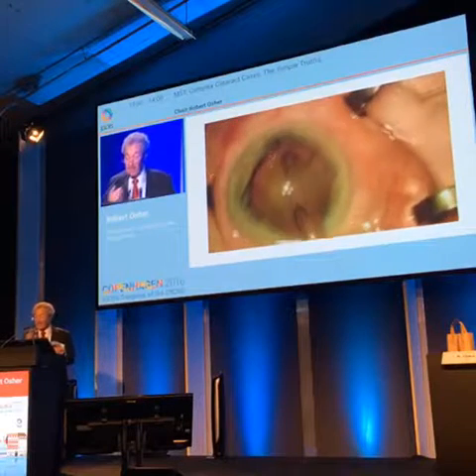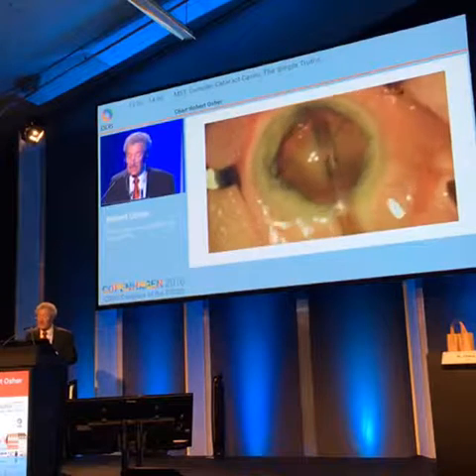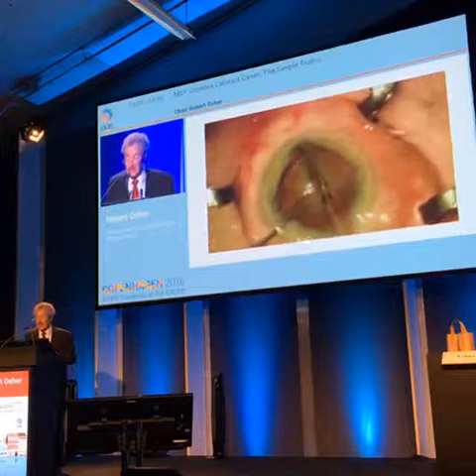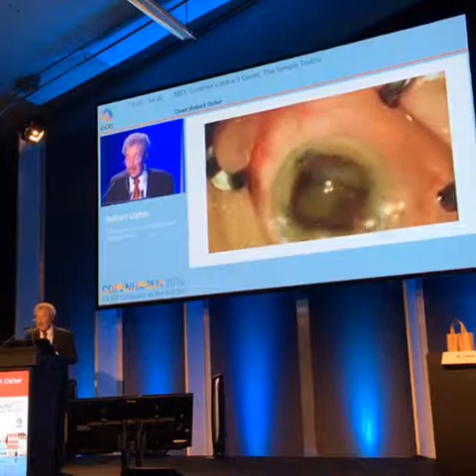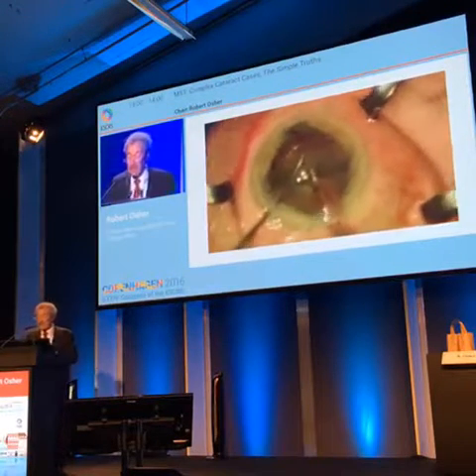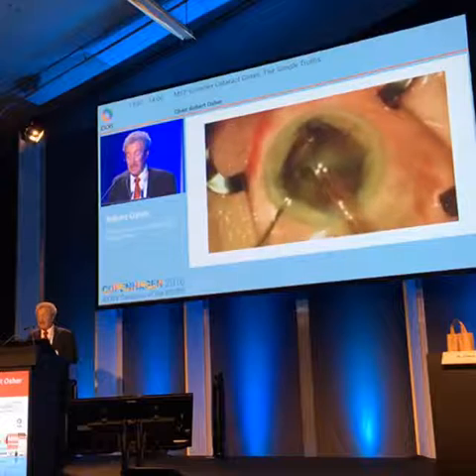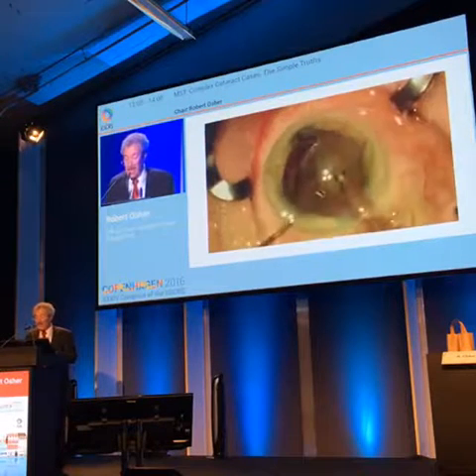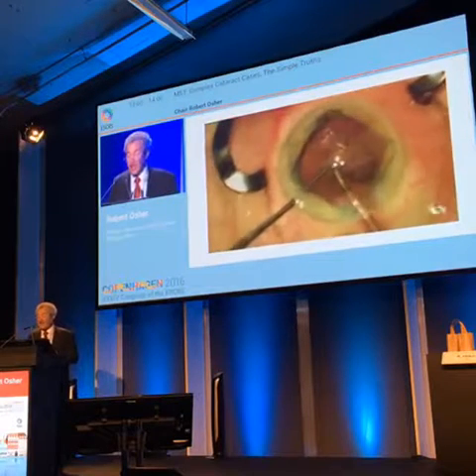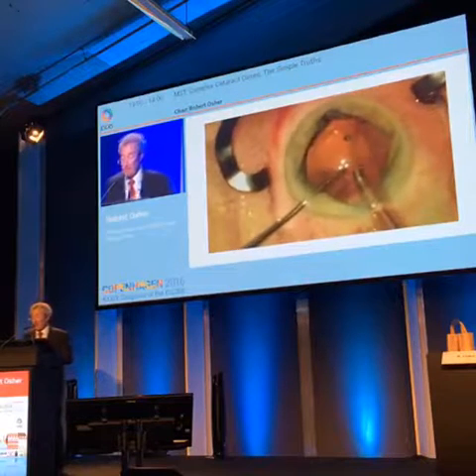I can use my bevel down phaco tip to work under Healon 5. I direct the energy backwards until I'm deep enough to sculpt at very low vacuum. So I leave the OVD in the chamber. I separate the lens into two hemispheres. This is a hard lens, hard by American standards. And then I'll bring each apex into the middle of the pupil. I use the bank technique, where I always have a bank of the adjacent quadrant next to where I'm working, which holds the capsule back.